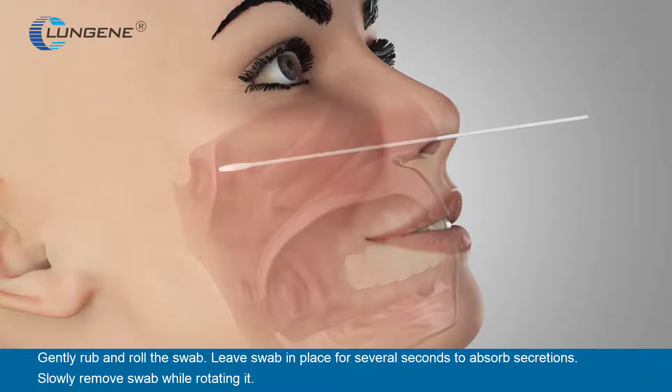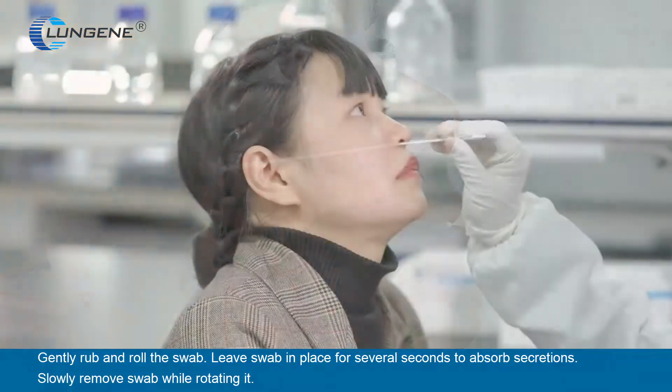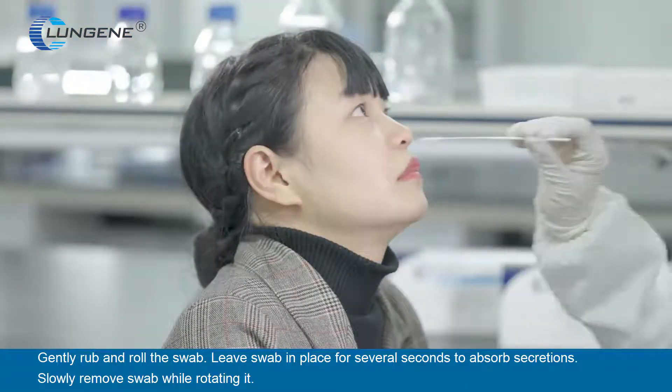Gently rub and roll the swab. Leave the swab in place for several seconds to absorb secretions. Slowly remove the swab while rotating it.